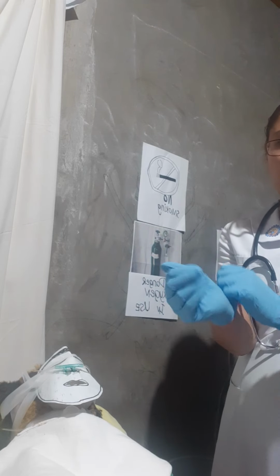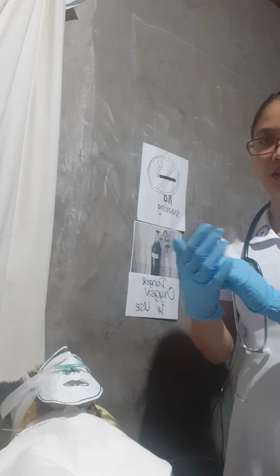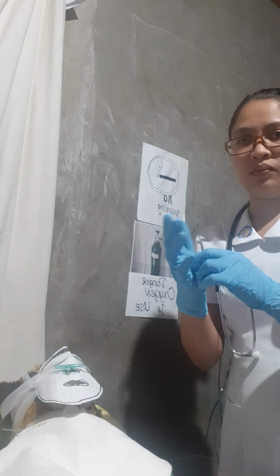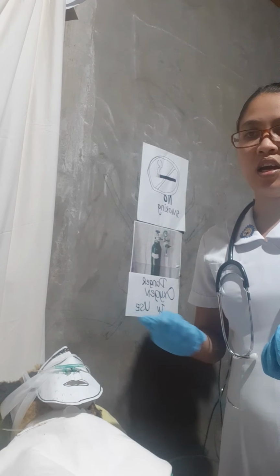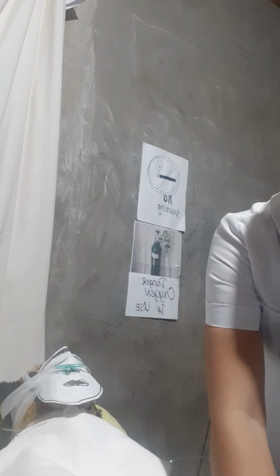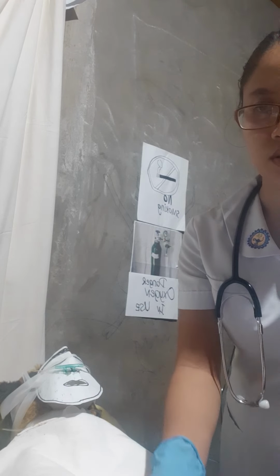Then open the sterile suction package using aseptic technique. Open the wrapper of the container carefully, and remove the container, not touching the inside, only the outside of the package. So we need to be careful.